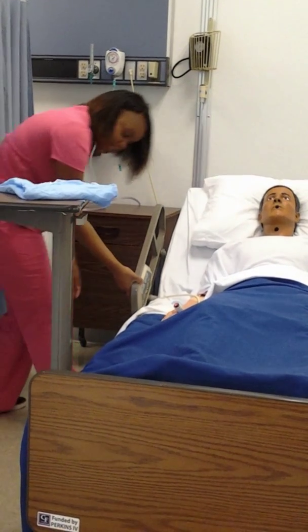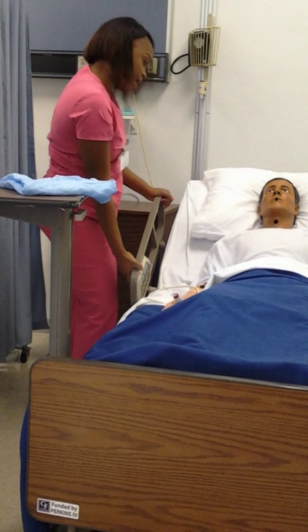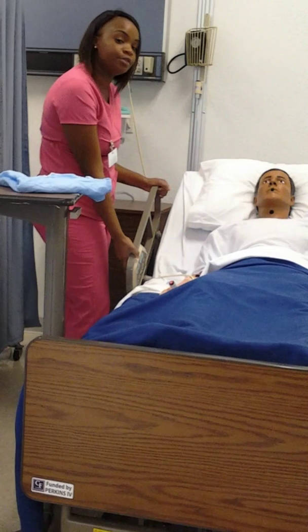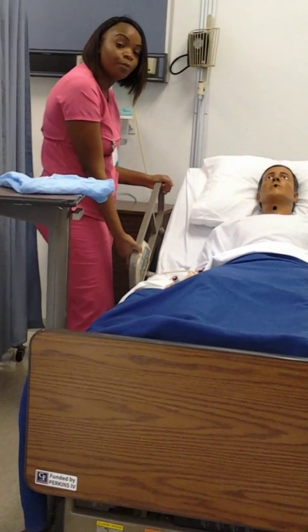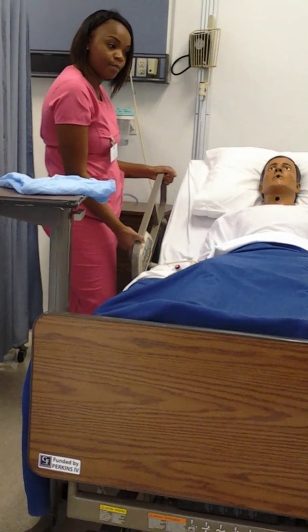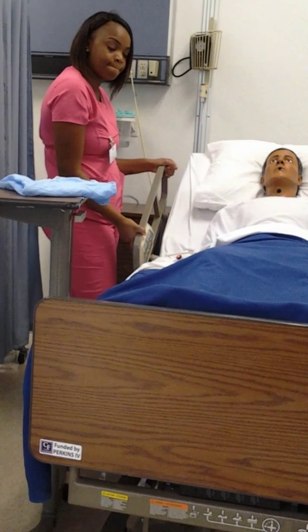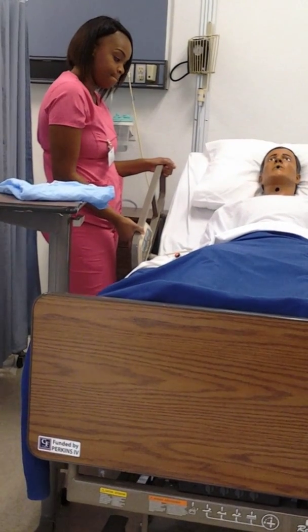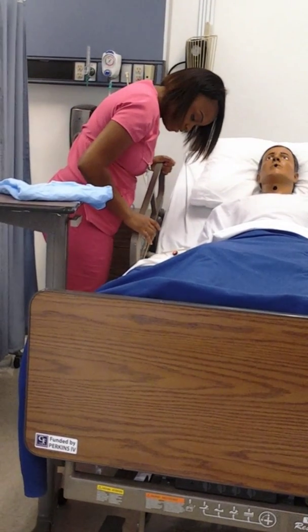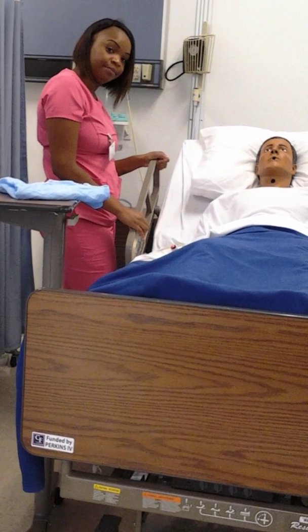I'm going to position the bed so that I'm comfortable. Going to go ahead and lift the bed up, okay? Okay. This is a sterile technique, so I'm going to be sure to remain sterile during the procedure. Position the patient in semi-Fowler's position. I'm going to go ahead and lift your head up a little bit, okay? Okay.